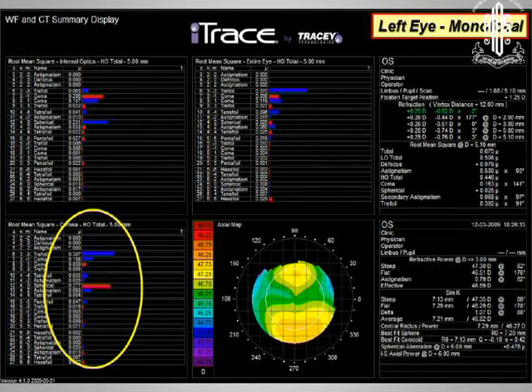So in other words, he had this coma from his cornea. He also had a large pupil, and that's the key. It's the combination of corneal aberrations and the larger pupil that creates the aberrations, the loss of contrast. And when you add the loss of contrast from the IOL, it became too much. If he had a very small pupil, because he was not as young, he was 55, you might be able to get away with that.